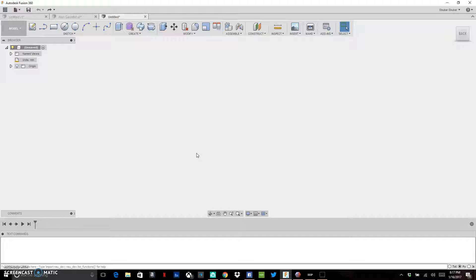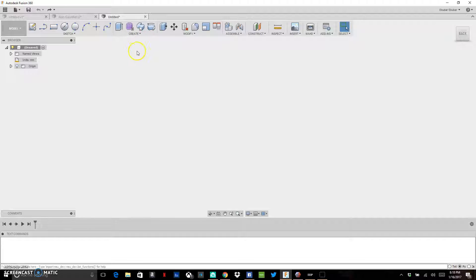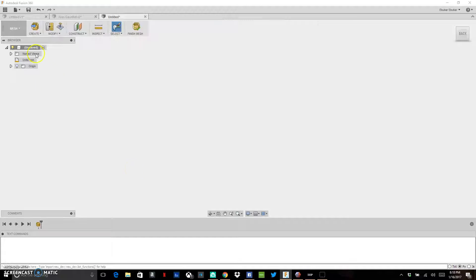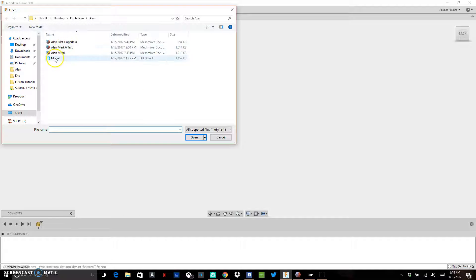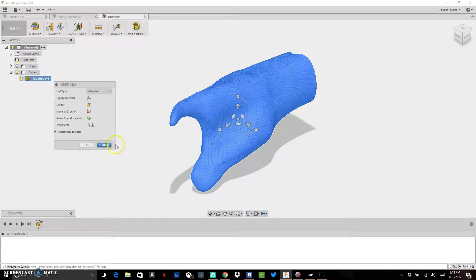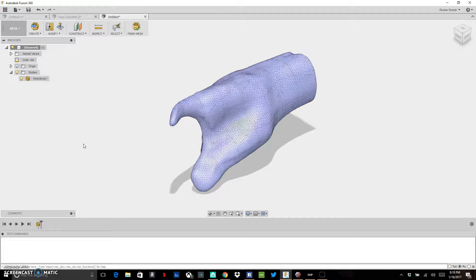Let's say you have your Mesh Mixer file — the 3D scan of your recipient's residual limb — and you want to do some modeling around that in Fusion 360. To do that, you first need to bring that model into the Fusion 360 environment. Go up to Create, then down to Create Mesh, and import your mesh by going to Create and Insert Mesh. I'm going to import the mold that I created in Fusion from my 3D scan.